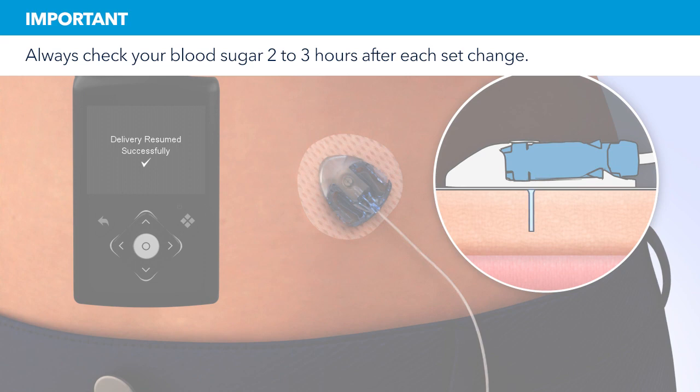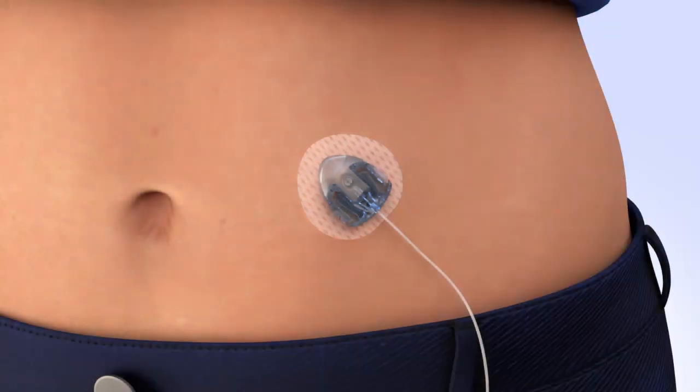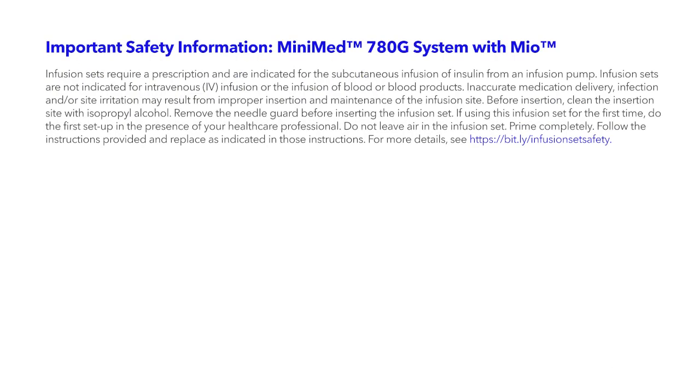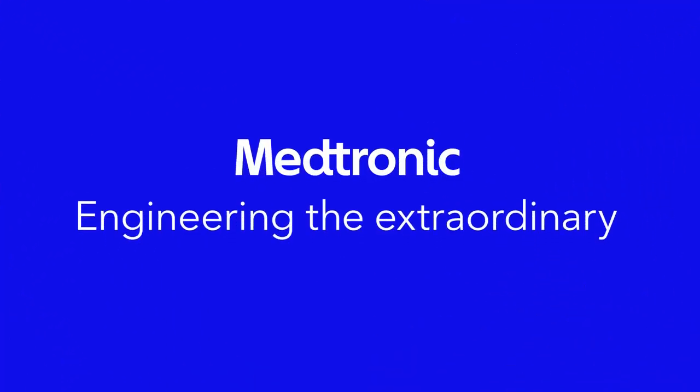Remember, two to three hours after inserting a new set, you should check your blood glucose. Checking your blood glucose is the only way to confirm your infusion set is properly inserted and that you're receiving insulin. Congratulations! You have successfully filled your reservoir and changed your site.